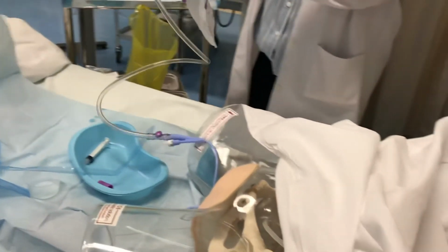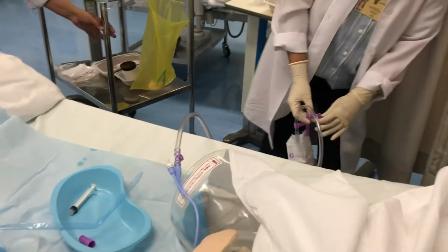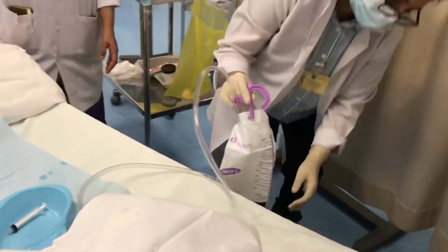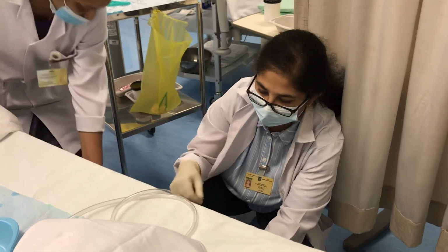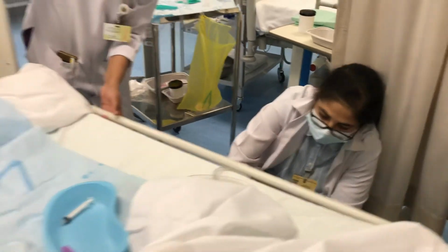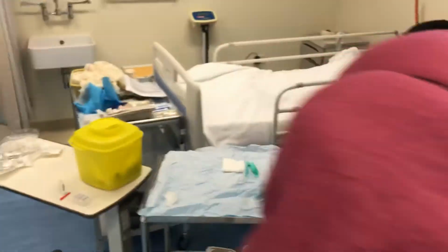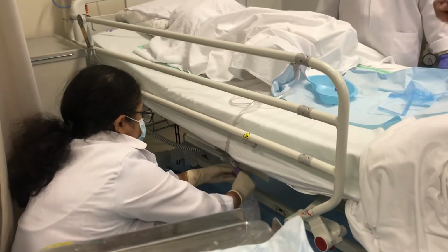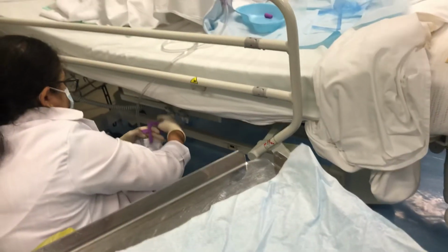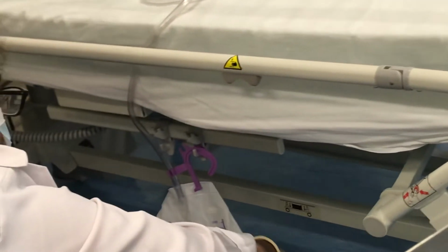And this will be hung down, in the sense below the waist. There is a special area where we can actually hold it. There is a hanger here. Many times they mistakenly put it on the side rail, so when they push the bed, it does not hang properly. In the hospital, there is a hook like thing.